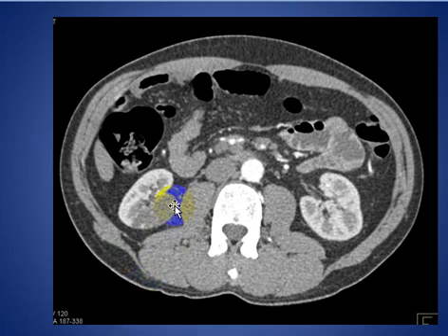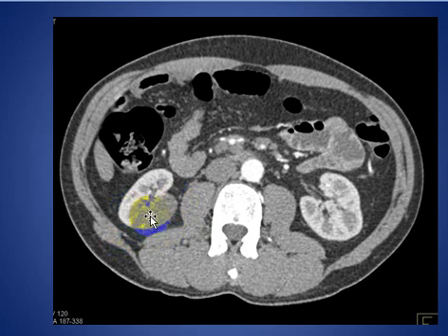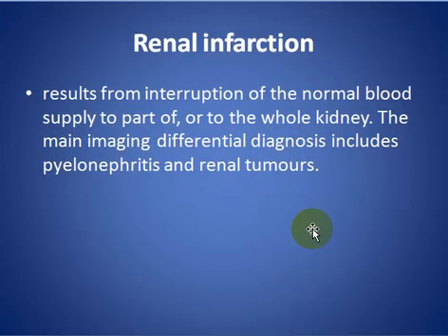Another differential diagnosis is renal tumor, but we don't see a renal tumor here. As we compare, there is no stranding and no swelling in the kidney on the right side, and this most likely represents renal infarction. Renal infarction is the interruption of blood supply to part or the whole of the kidney.